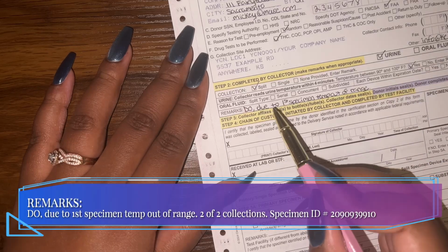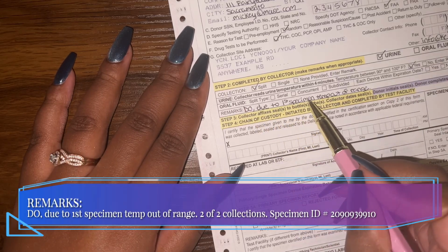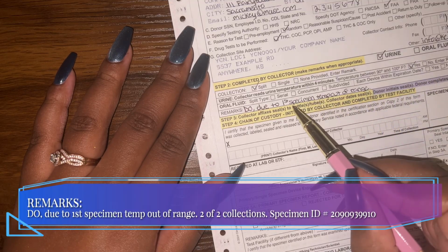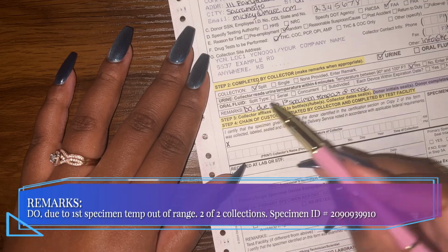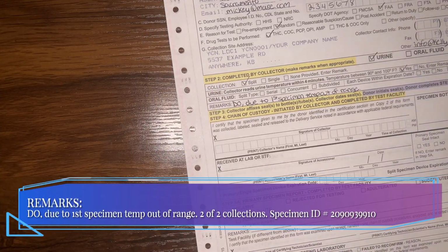So we're telling them we're doing a direct observation due to the first specimen being temp out of range. So they will know there's another specimen that goes with this one. It was temp out of range. That's why we had to do a direct observation. You have to explain why you're doing a direct observation.